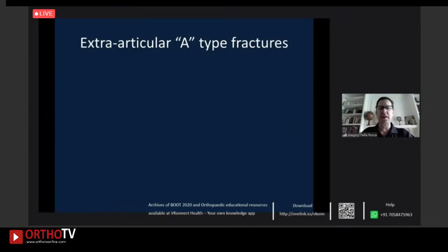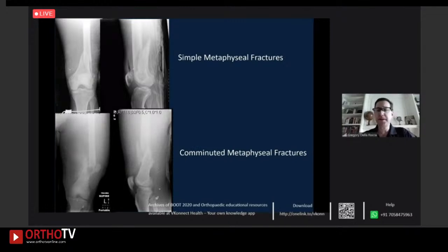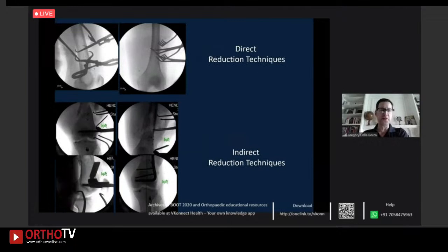Two cases illustrate extraarticular distal femur fractures — one from a car crash, one a gunshot wound — showing simple metadiaphyseal and comminuted patterns. The simple fracture may be reduced directly, with lag screws and a neutralization plate. The comminuted fracture is amenable to bridge plating. Using soft tissue sparing techniques with strategically placed clamps, a direct reduction can be achieved on the simple fracture, while for the comminuted one we restore alignment using a femoral distractor, table traction, or an assistant with bumps.